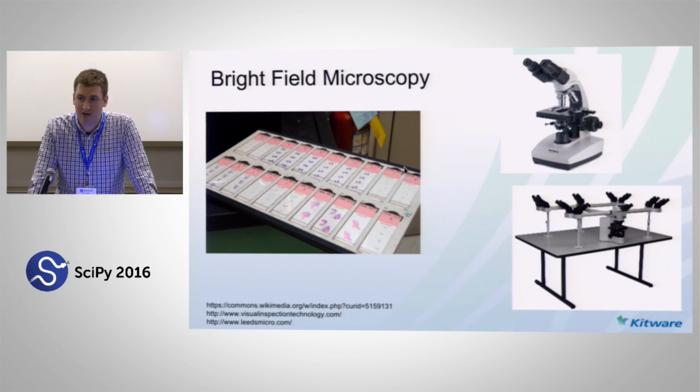Now, the state of the art in microscopy in the clinical world is still actual physical glass slides and microscopes, and if you want to collaborate with multiple people, you all crowd around one of these big lens microscopes where you have multiple viewfinders for each user.